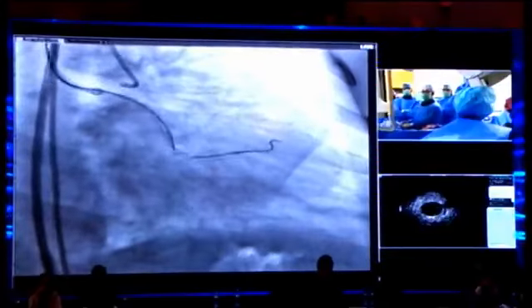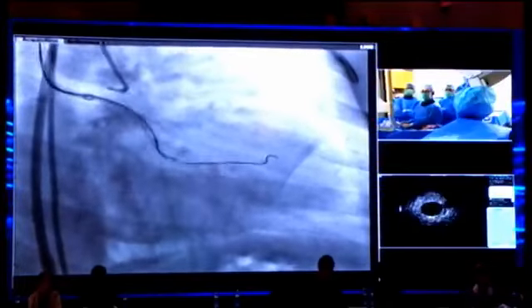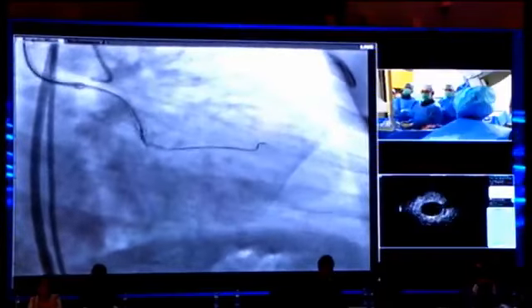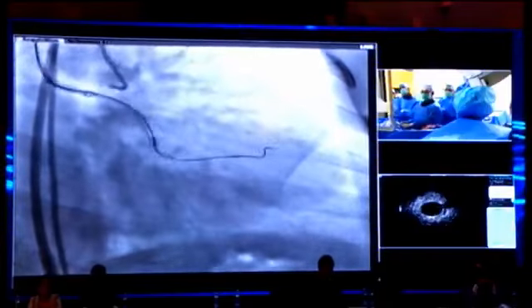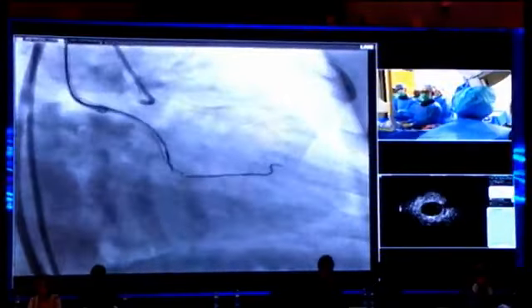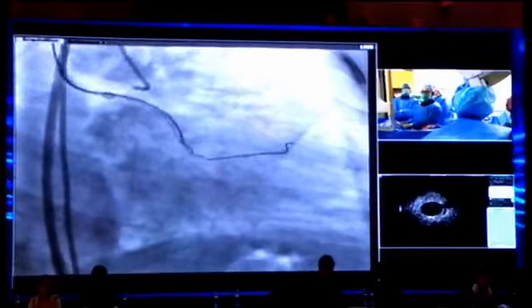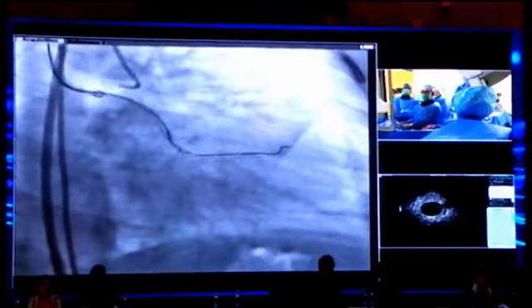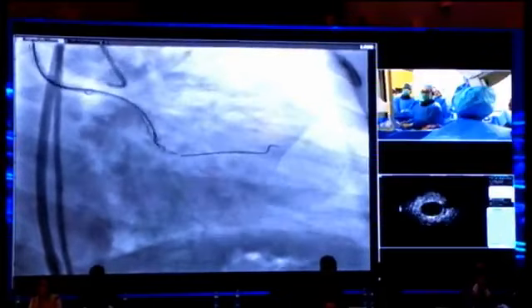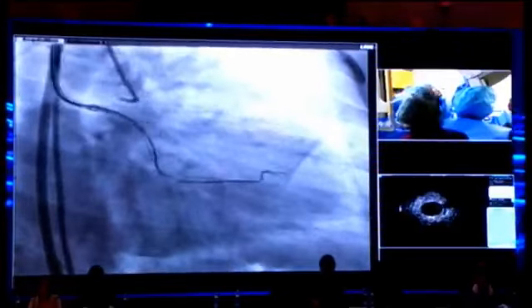Hello, Dr. Nagamatsu. This is Dr. Matsu. From the IVUS imaging, I can see clearly whether the tissue is soft or not. So in this situation, using VH IVUS is better for me. But you are now using Boston IVUS, so in this situation maybe I use Gaia Next or something. I think the Gaia series, the intermediate, Gaia Second or Gaia Next. Yes, I want to use that.